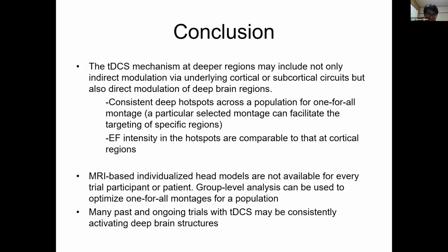So if we want to avoid this, we may try to use small electrodes, or if we want to engage deep regions, we can consciously use large electrodes. There are also other techniques, for instance, interferential currents, that maybe we will discuss in the next presentation. With those it may also be possible to reach deep region modulation.